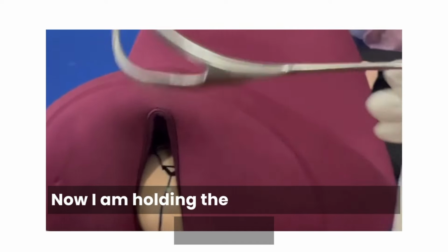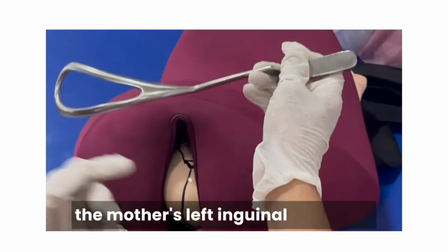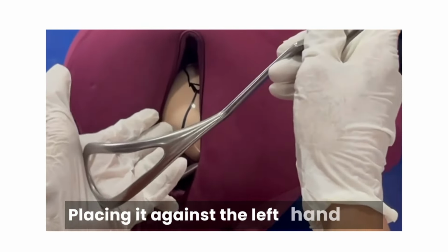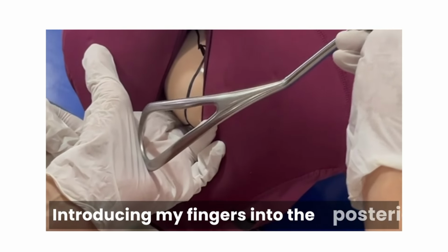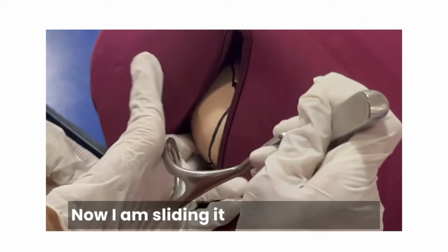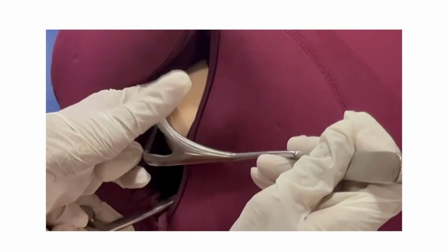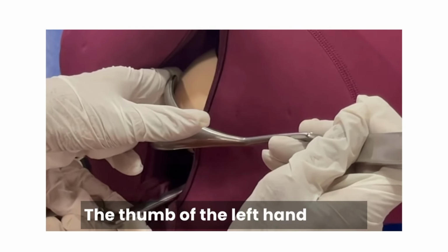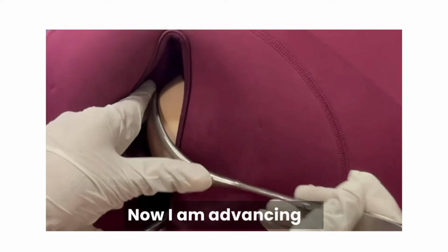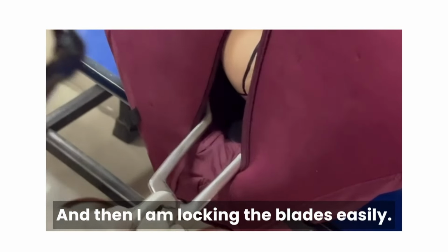Now I am holding the right blade with my right hand. The shank is parallel to the mother's left inguinal ligament. This is my left hand, placing it against the left hand palm, introducing my fingers into the posterior aspect of the maternal pelvis. Now I am sliding it along the fingers. My fingers are moving now towards the maternal right side. The thumb of the left hand is now going to the heel of the blade. Now I am advancing it and then I am locking the blades easily.